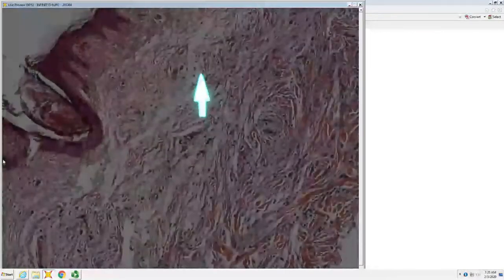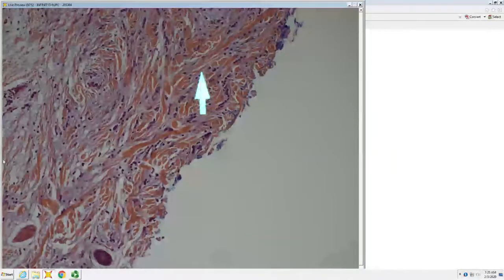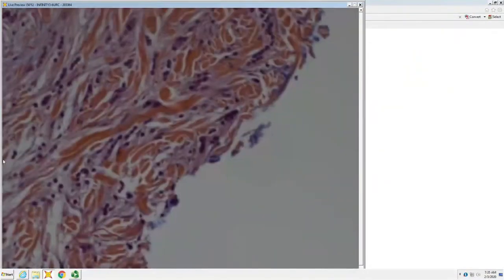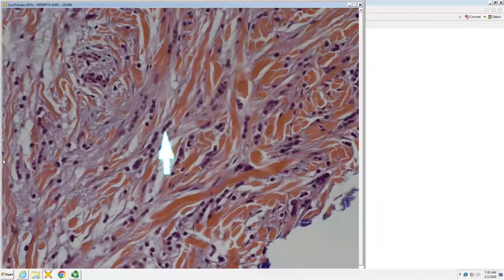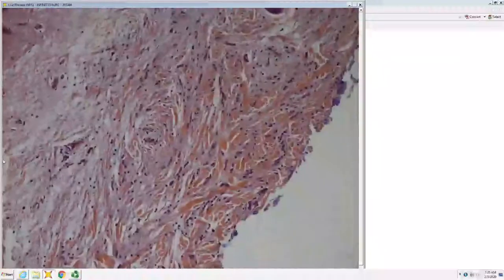How about this one, Katie? Cells lining up, splaying collagen. So single cells between splayed collagen, lots of new ropey collagen, some mucin as well. And the cells flatten, there's nuclear molding, so they flatten against one another like boxcars. Yeah, carcinoma en cuirasse.